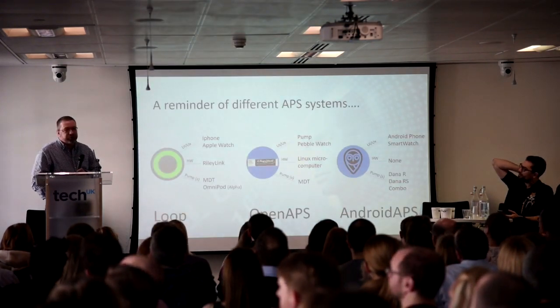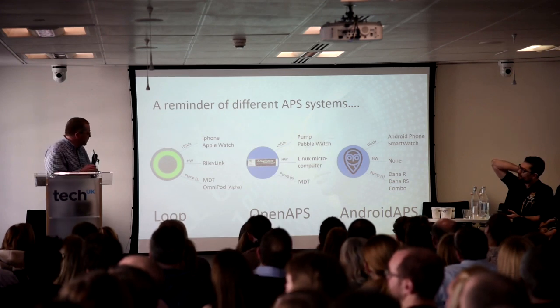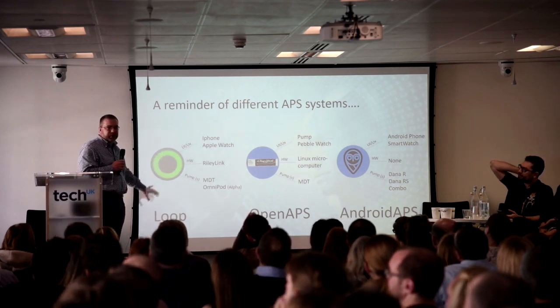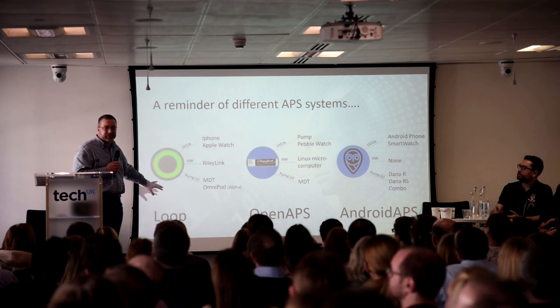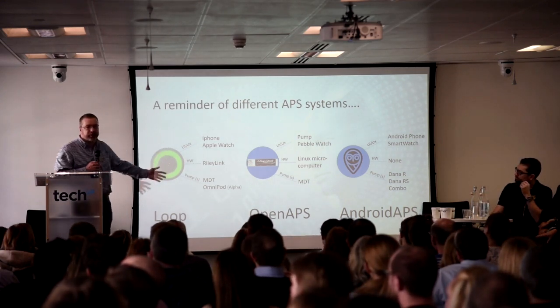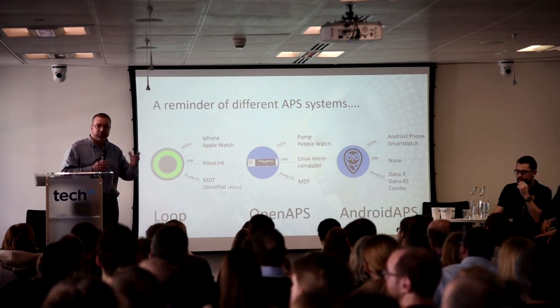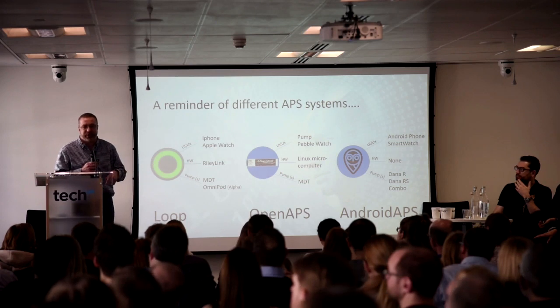We've talked about 2 of the 3 main loop systems available today. We haven't really talked about Loop. I'm an iOS person, so I started playing around with Loop as my first system. You have an iPhone, you have a small transmitter that effectively converts Bluetooth to a radio frequency, and that talks to an electronic pump.